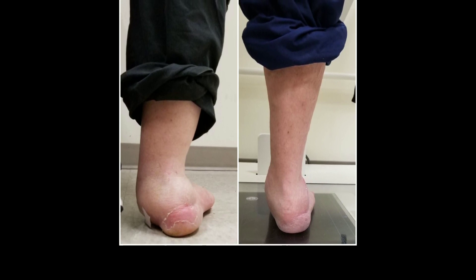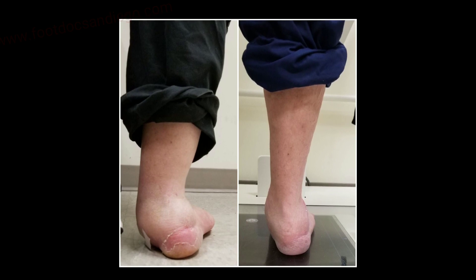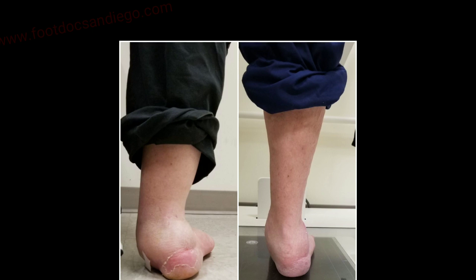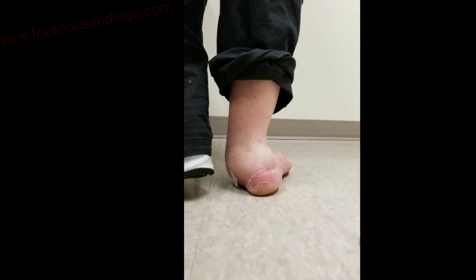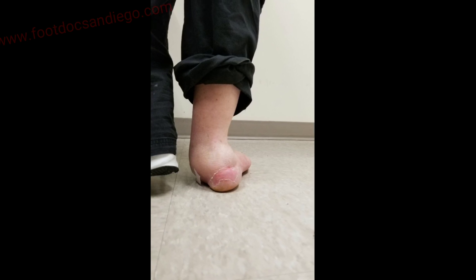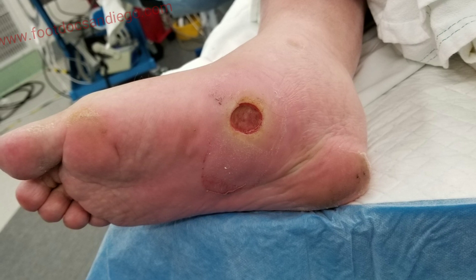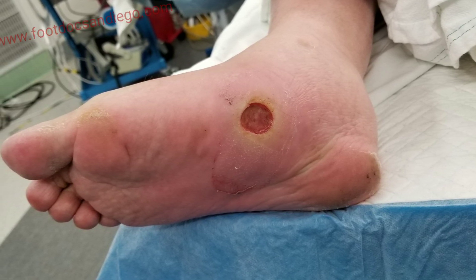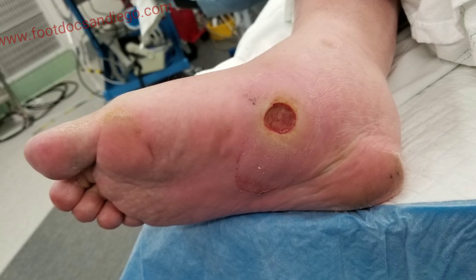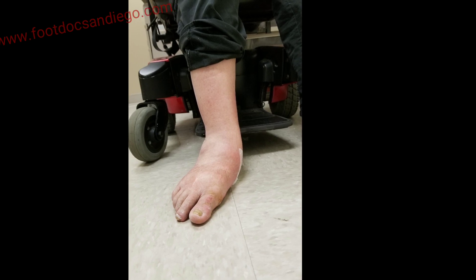Here you can see on the left a dislocated Charcot foot, and on the right after a full correction. These deformities are multi-planar and quite complex due to the multiple bones involved and the need for gradual deformity correction as opposed to doing it in one acute shot. The patient was ambulating on this foot, developing an ulcer under the talar head portion of the foot. This was a floppy foot that dislocated with no integrity to the structural arch for propulsion and walking. This was very difficult for the patient, as the patient was a diabetic and already had a below-knee amputation on the other leg, thus putting the patient at high risk for being a double amputee.